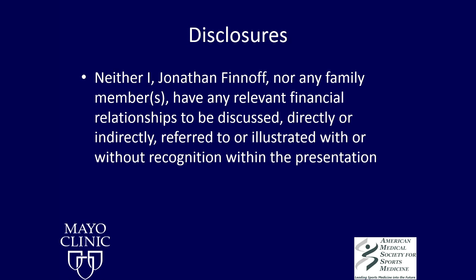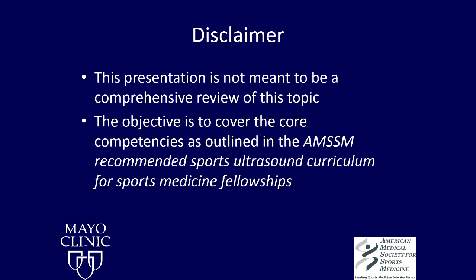I don't have anything relevant to disclose, but I do have a disclaimer. This presentation is not meant to be a comprehensive review of ultrasound of the entire elbow or every type of pathology in the elbow. Rather, its objective is to cover the core competencies as outlined in the AMSSM recommended sports ultrasound curriculum for sports medicine fellowships. So that is specifically what this talk will talk about.